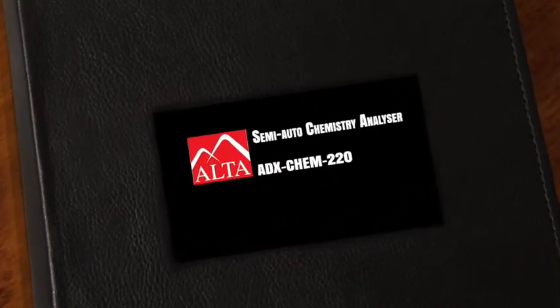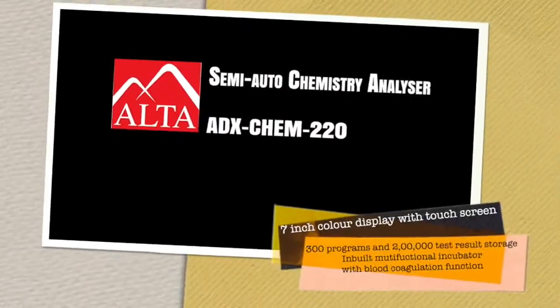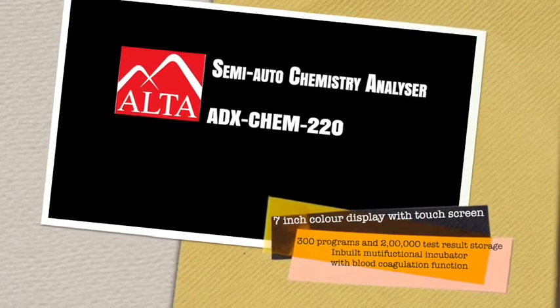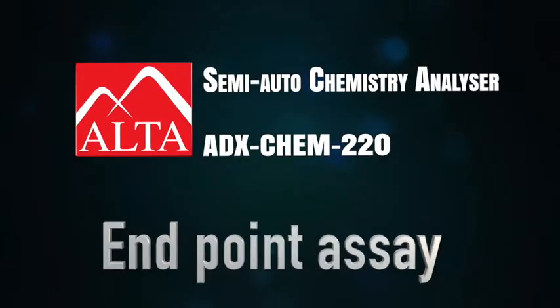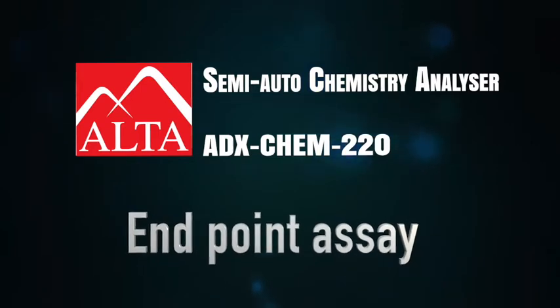Let's learn programming in Alta Chem 220. To begin with, let us start with an endpoint reaction. Endpoint assay is one in which sample is incubated with buffer substrate for a fixed period of time, and at the end of the reaction it is stopped and the amount of product formed or substrate used is estimated.